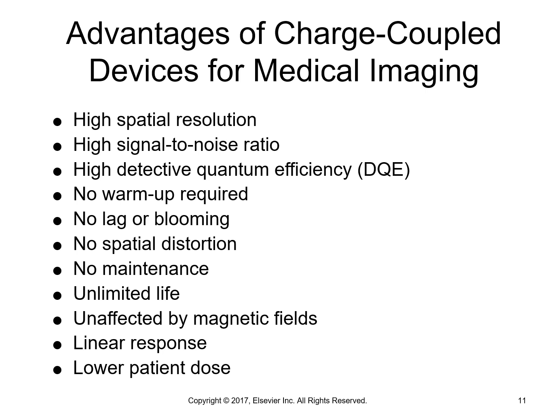Unaffected by magnetic fields. The early video cameras involved electron streams, and so Michael Faraday says you can deviate. If you apply an external magnetic field to a charge, you can make the charge move, and so that electron stream can be altered by a strong magnet. So that's one of the ways you sabotage early television equipment and early fluoroscopes: you bring in a strong magnet and it basically ruins the TV signal. Okay. That was also a prank you can pull on your grandmother with her cathode ray tube television back in the day.